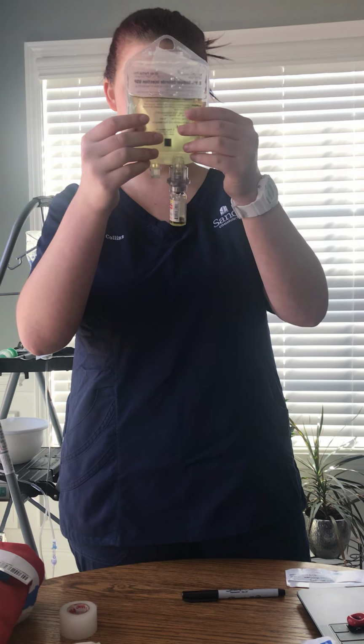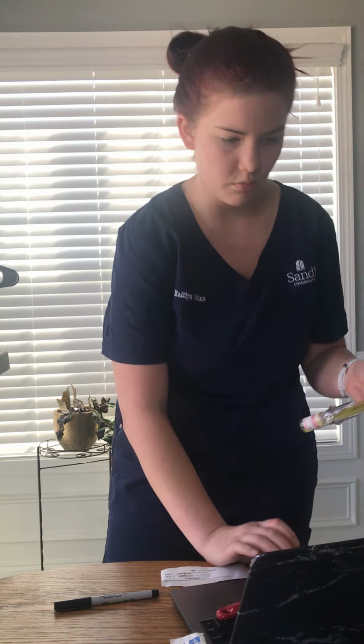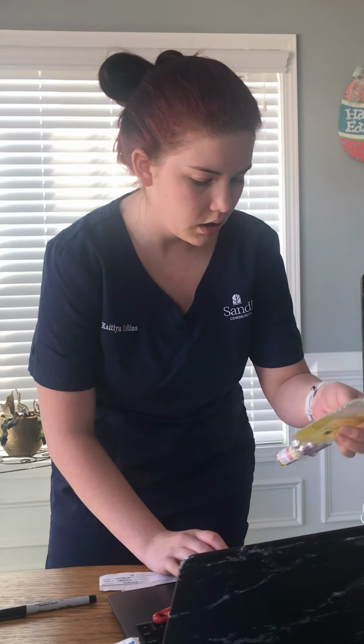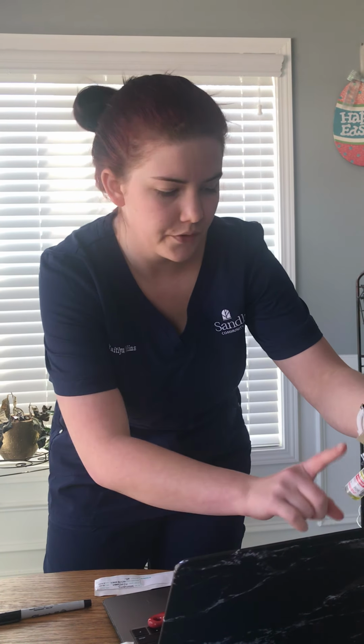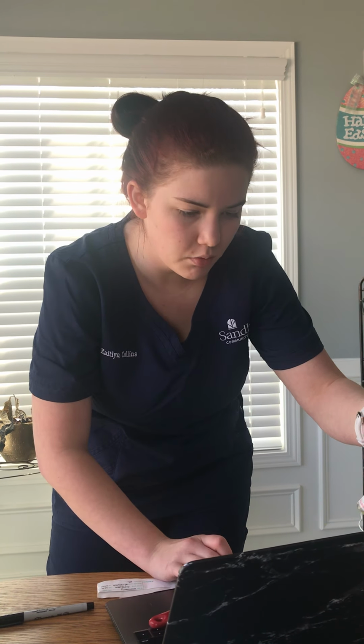So I've labeled it and we're good to go. So I'm going to check the name of my medication again with the vial, and it is cefazolin. Cefazolin on my label, cefazolin here.